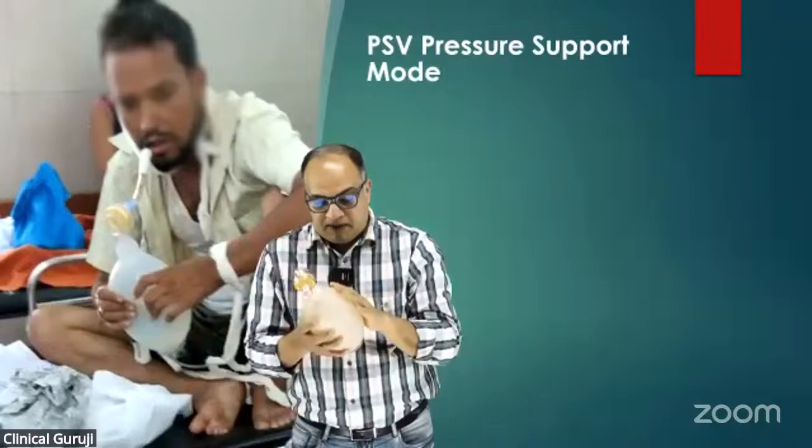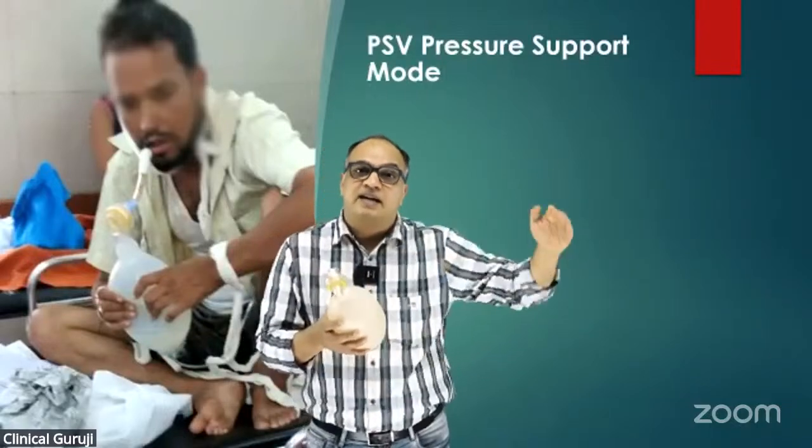Now what is the difference? All breaths have to be triggered by the patient. The ventilator is sitting idly. 1, 2, 3. Patient triggered a breath. The ventilator will give a predefined pressure, not tidal volume. The ventilator will generate some amount of pressure in the patient's airways. Get me right? Previously, the ventilator was giving a fixed tidal volume. Now the ventilator is not giving a fixed tidal volume. It is just increasing the pressure of the airway by a certain amount.